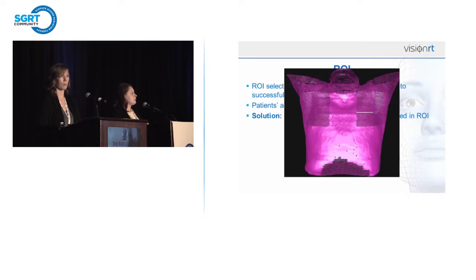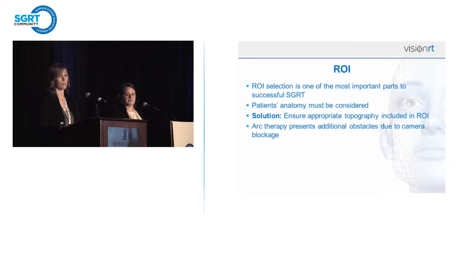And again, it's always important, especially for those ARC treatments, to make sure that we're wrapping the ROI across the body and getting both lateral sides of the patient.